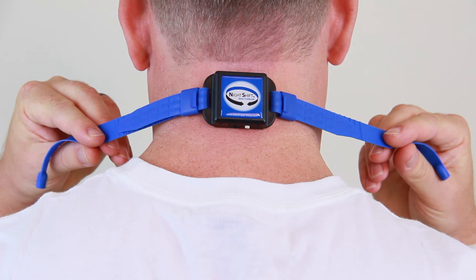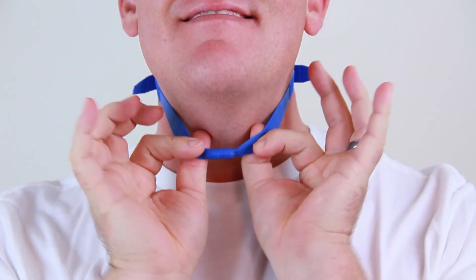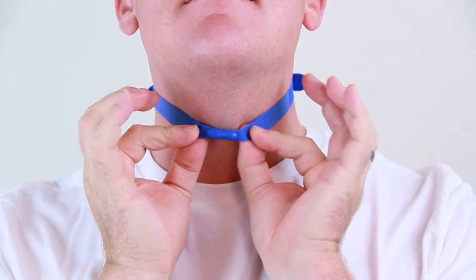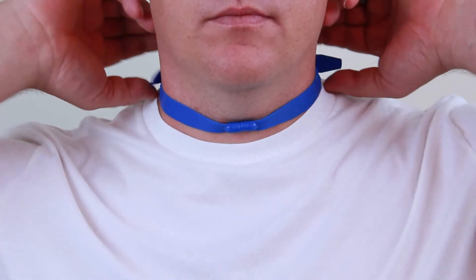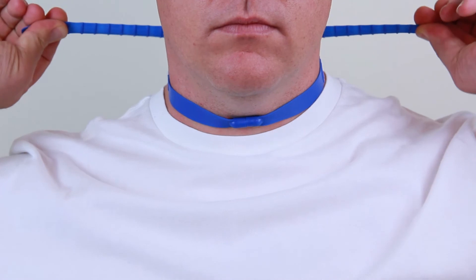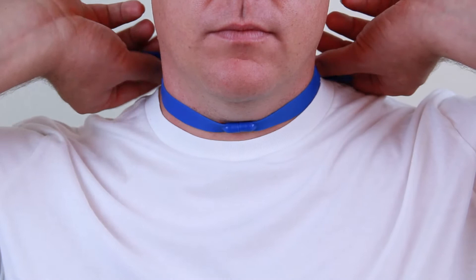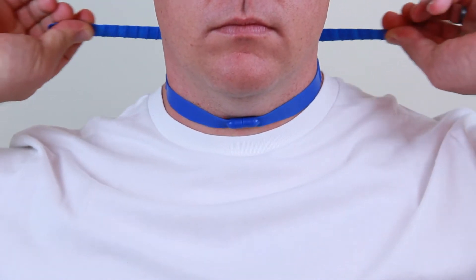Center the Night Shift on the back of your neck with the blue label facing out and the on-off button facing down. Now fasten the magnetic clasp. Grasp the strap ends on both sides and pull evenly until the Night Shift is secure, while keeping the device centered on the back of your neck and the magnetic clasp centered on the front.